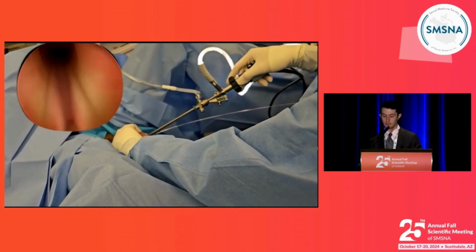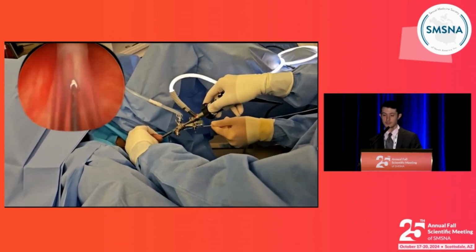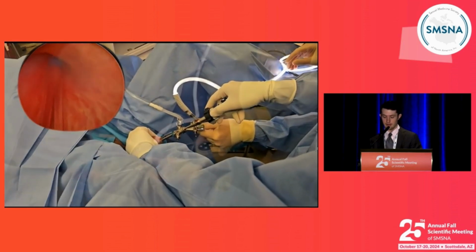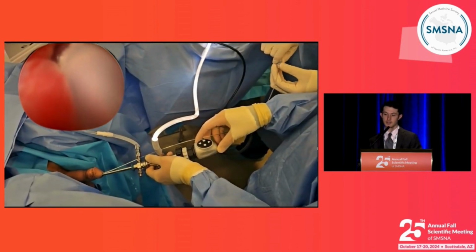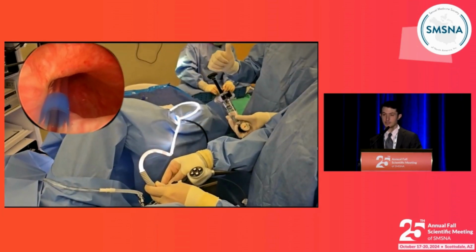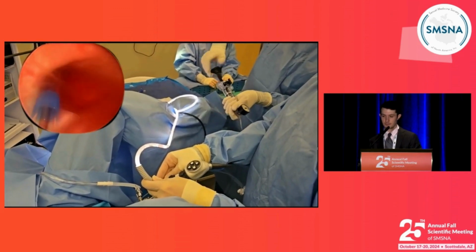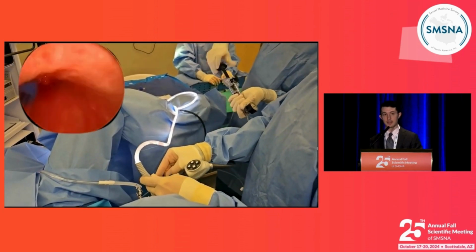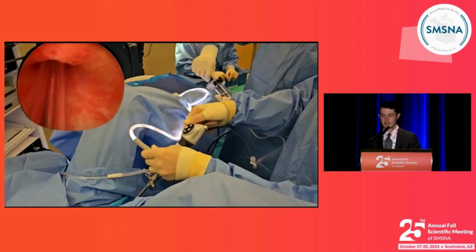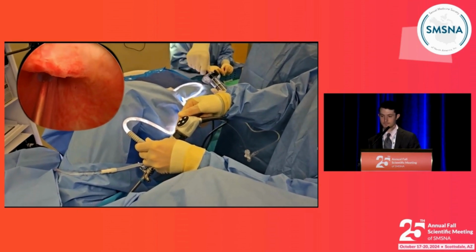Now, after removal of the working bridge, the pre-dilation balloon is inserted to the level of the bladder, followed by removal of the outer sheath. The cystoscope is then reinserted alongside the placed pre-dilation balloon to confirm its positioning, with that blue marker seen there lying at the distal edge of the external urethral sphincter. The balloon is then connected to the dilation device and inflated up to 3 to 4 atmospheres of pressure. Now at this point, there will either be a sudden drop in pressure, as seen on the pressure gauge, or visual bleeding seen cystoscopically, which can signify that the anterior commissurotomy has been achieved.